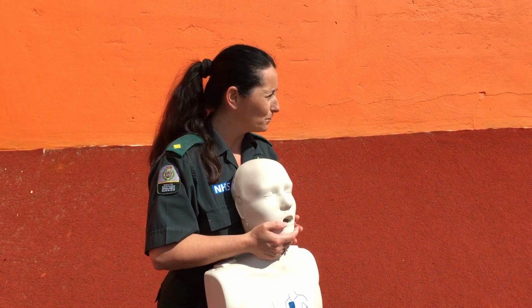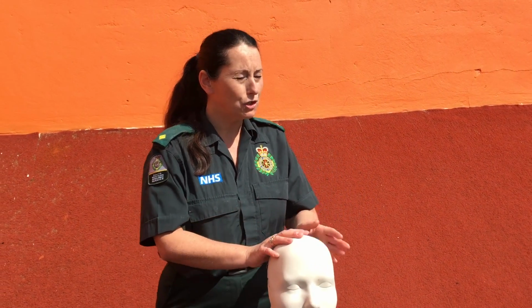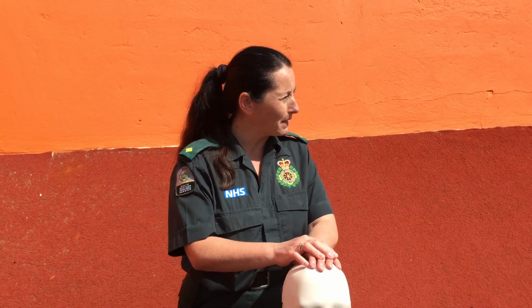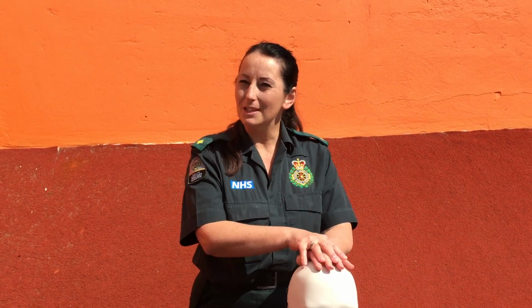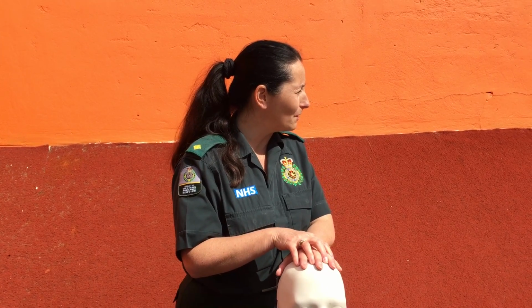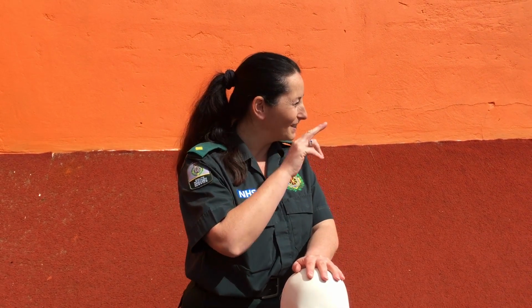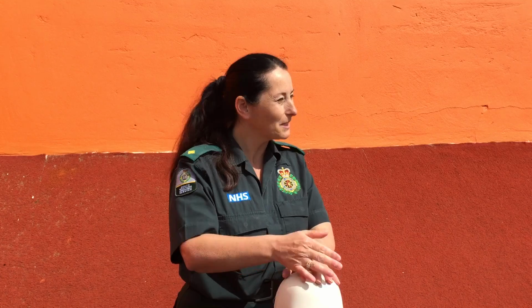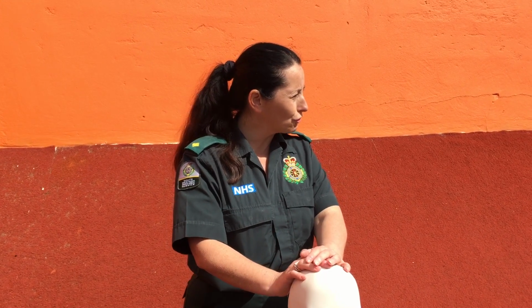Under 1s, do you think you would put the pads on a baby under 12 months? No. Right, you don't even consider putting those pads on a baby under 12 months. You don't shock a baby. And does anyone know how you do CPR? 2 fingers. Yeah, 2 finger compressions. So under 1s you don't shock. Between 1 and 8, the pads go front and back. And any child over the age of 8 you would treat as an adult.